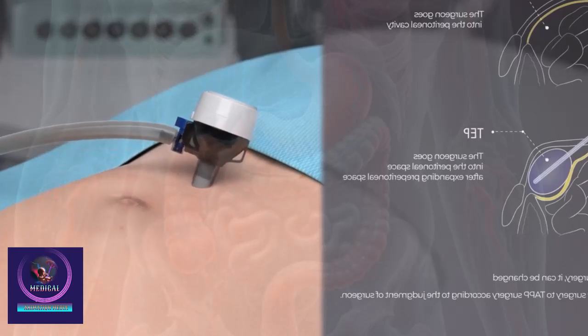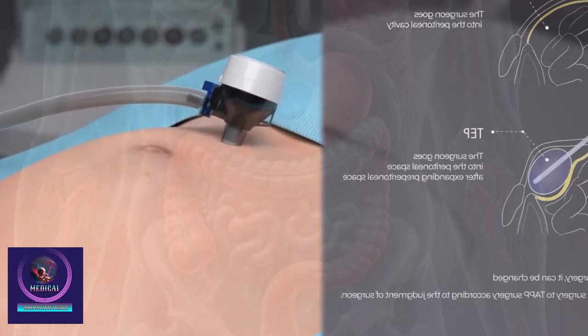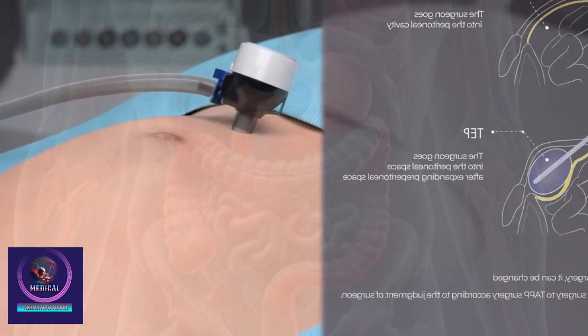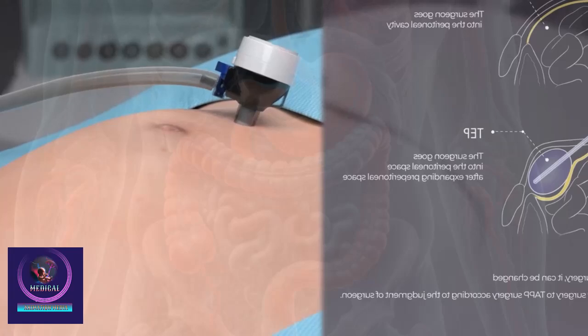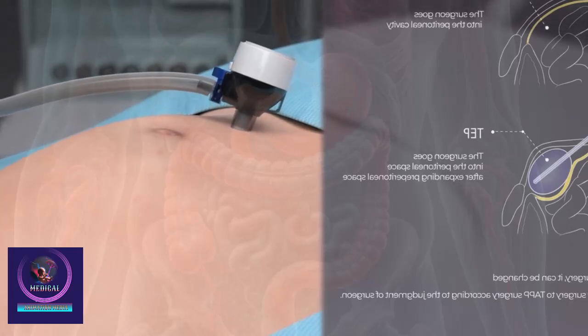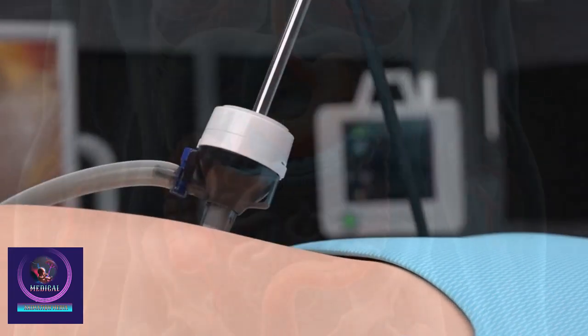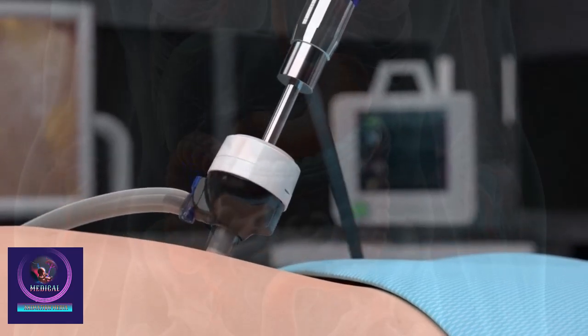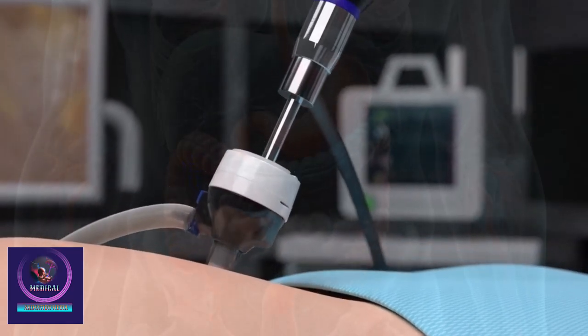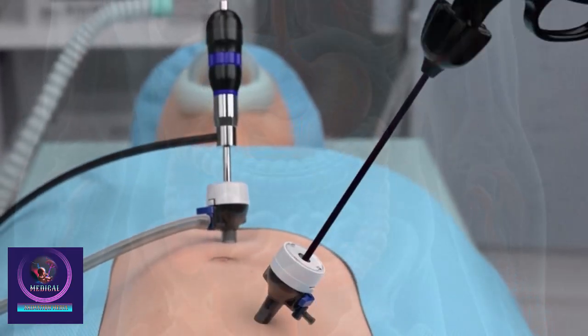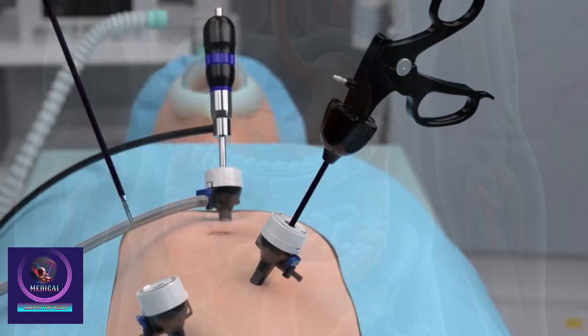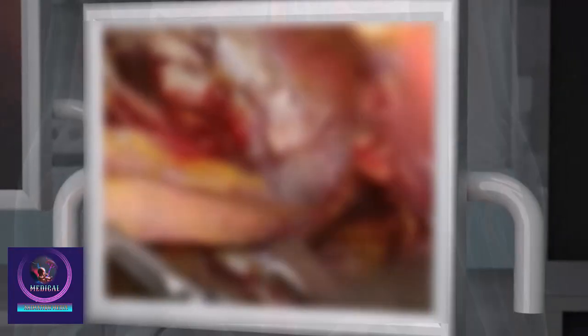At this time, if the extraperitoneal space is narrow and difficult to approach, an intraabdominal approach is performed at the discretion of the operator. The endoscopy camera is inserted into the extraperitoneal space through a trocar, and then two more holes are made to insert the laparoscopic instruments. The operator performs the operation while looking at the camera image projected on the monitor.